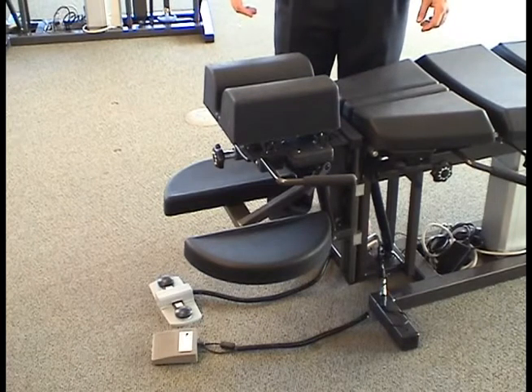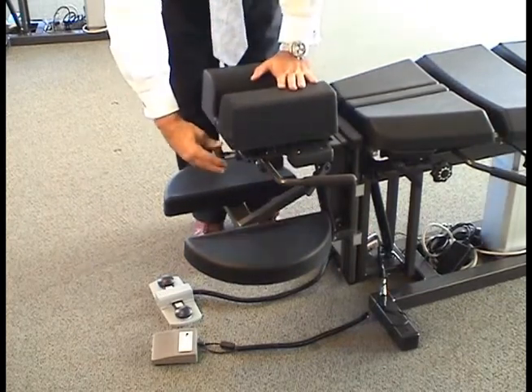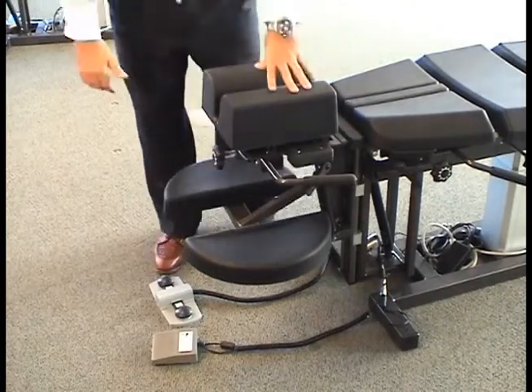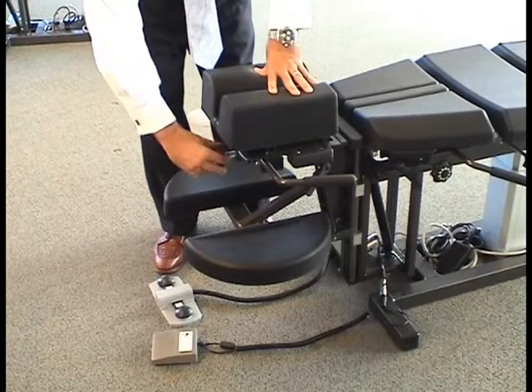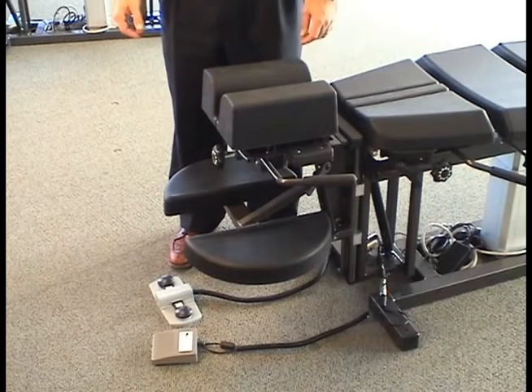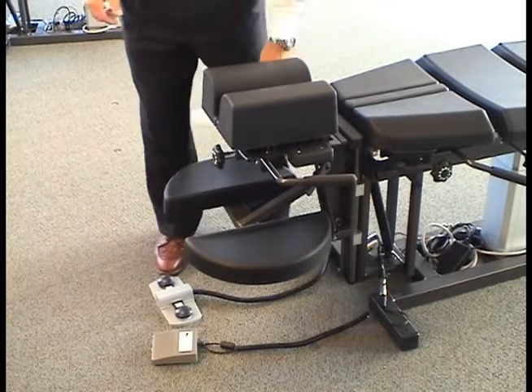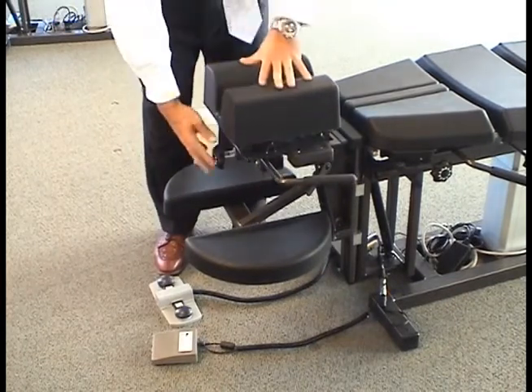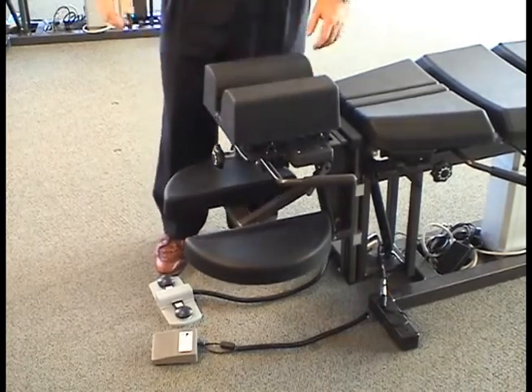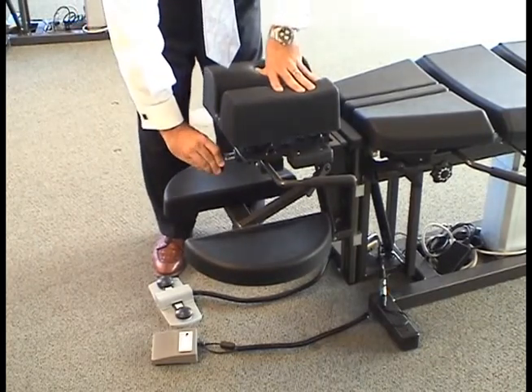Tension setting. All PCT tension knobs, except for the headpiece, are bilateral. Each tension knob covers the full spectrum of tension in just 2 1/4 turns. On the lowest tension setting, the weight of the table pads themselves is enough to cause that section to drop. At its highest tension setting, the headpiece requires a high amount of force to get the section to drop. It does not require much rotation of the tension knob to create a great change in tension setting.